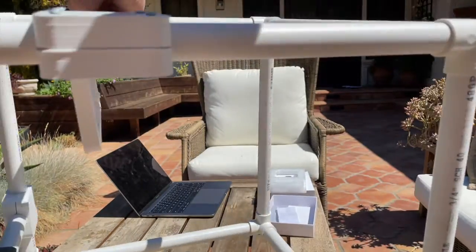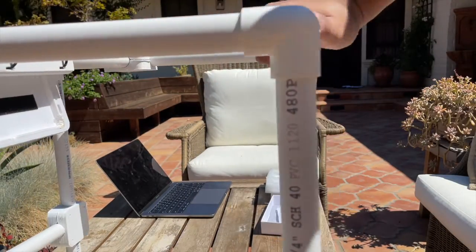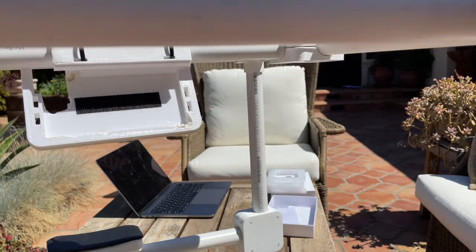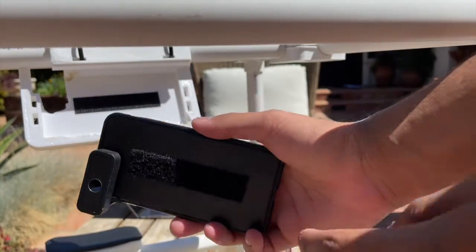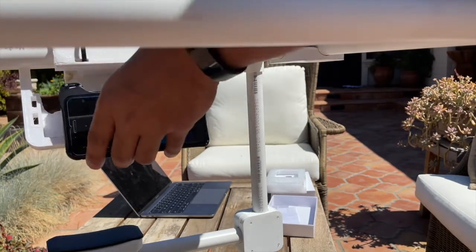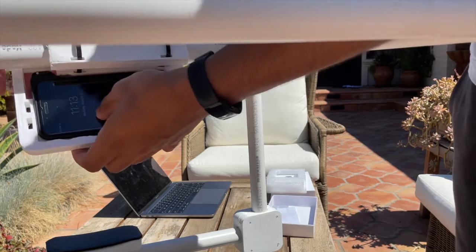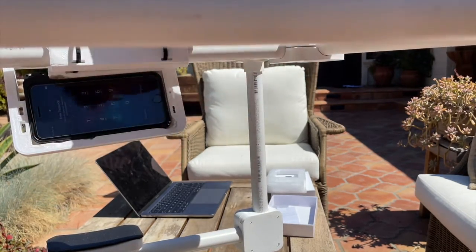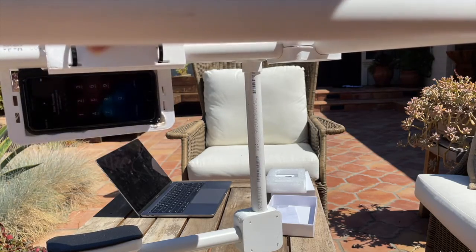So now we're going to place the phone into the phone mount on the retinal rig. The phone mount is a white piece that holds the iPhone. And on the iPhone, there's a piece of Velcro, which aligns with the piece of Velcro on the phone mount. So we're going to place it in and make sure those align. And then we'll press in the edges to make sure that it's secure. If you flip it over, it's not going to fall out in this position, especially with the Velcro.